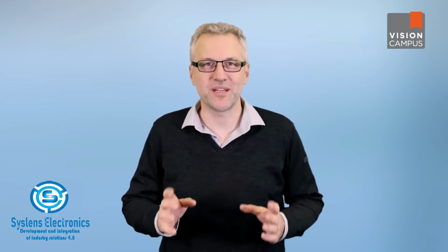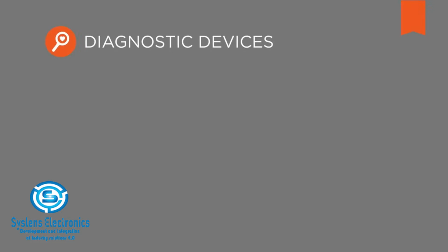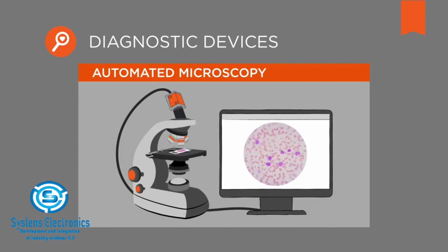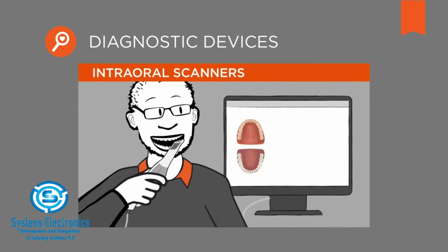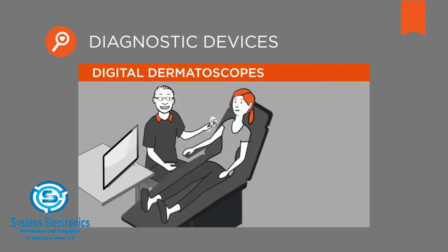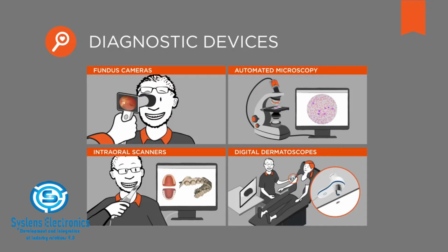Today, with the help of imaging and vision technology, there are many camera-based diagnostic devices on the market. There are fundus cameras to check the back of a patient's eye, automated microscopy for the analysis of body fluids such as blood or urine, intraoral scanners that help eliminate the uncomfortable wax stamp that nobody really likes, digital dermoscopes for identification and tracking of suspicious skin regions, and many, many more.